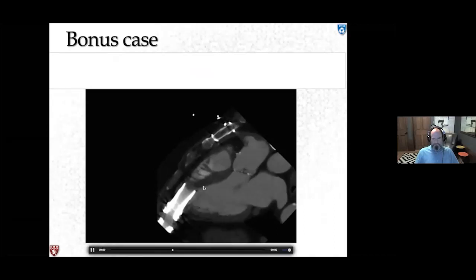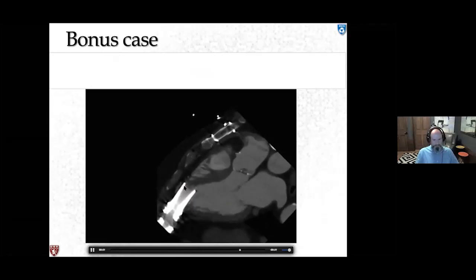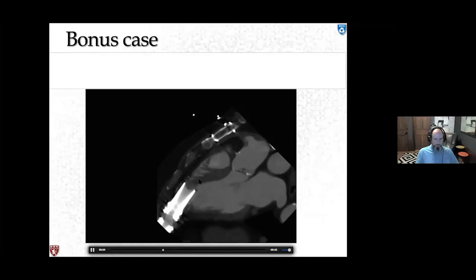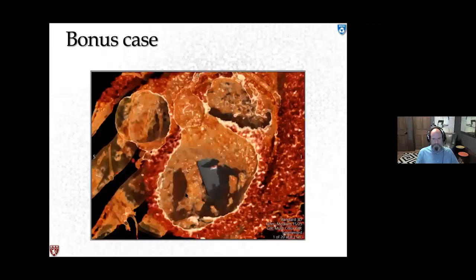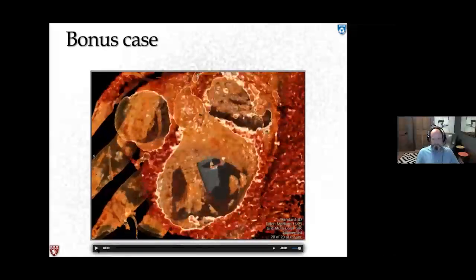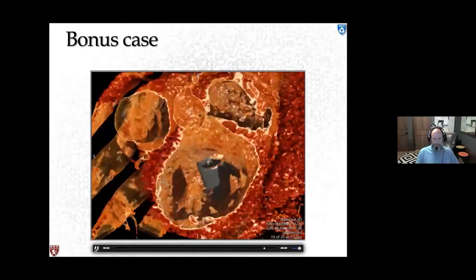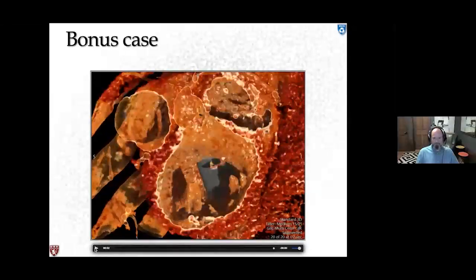Bonus case: LVAD inflow cannula malposition, mostly seen with HeartMate II — unlike HeartMate 3 or HeartWare which sit in the pericardial space and allow more repositioning. The HeartMate II is a massive device with limited adjustability, and can become angulated toward a ventricular wall. In this three-chamber view, the inflow cannula is angulated toward the anteroseptal wall, and on functional imaging we can see the myocardium being sucked into the LVAD throughout the cardiac cycle, eventually closing off the inflow cannula.